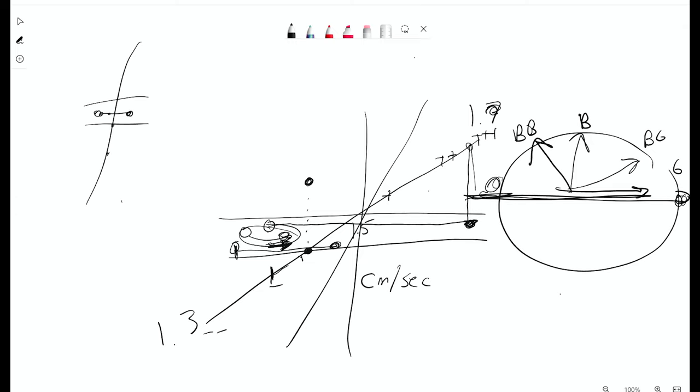The thing in phase contrast outside the brain is that, even in CSF flow studies, we're trying to measure not only the direction of the flow, but also how fast it's moving. I think people don't understand this. Maybe I'm generalizing, but I think there is a big difference between visualization and quantification in MRI, and it gets kind of overlooked, right?